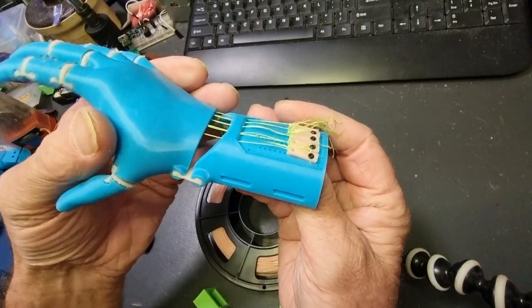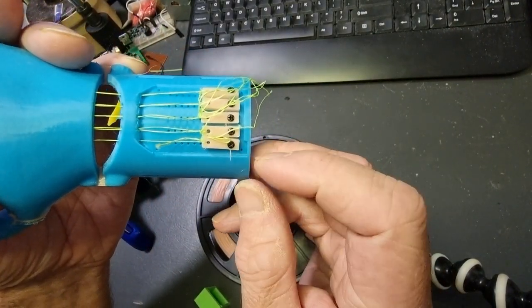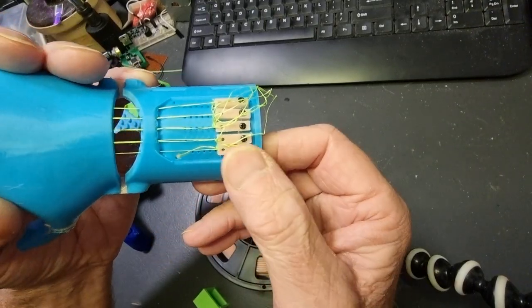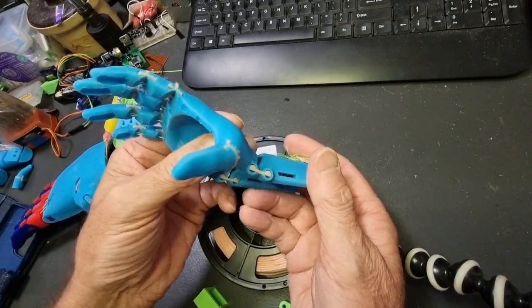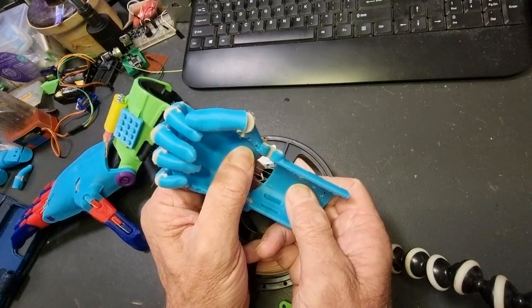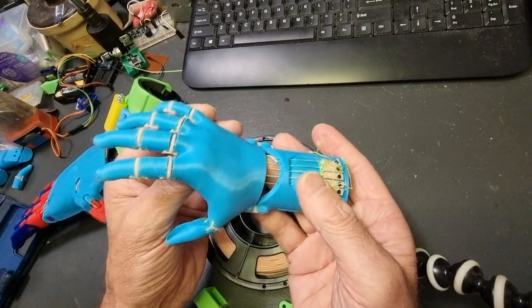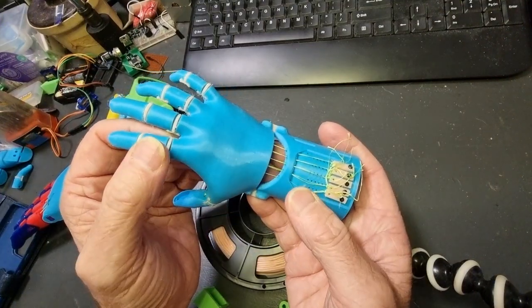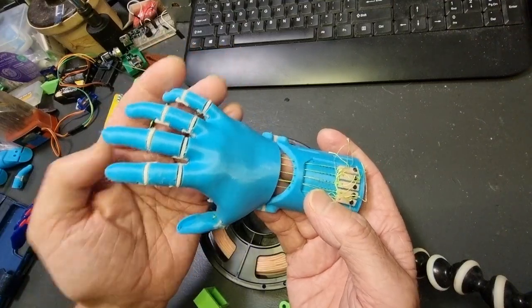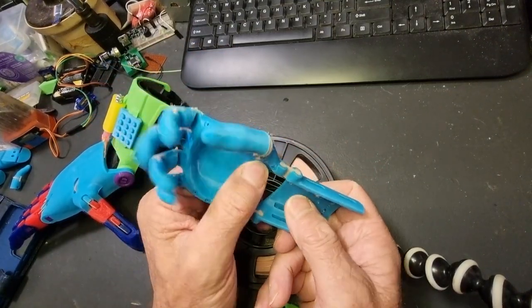With this hand, the tensioner blocks are also printed in TPU, so they're slightly stretchy if you have to put a lot of pressure on them — they can stretch a little bit. This works really well. So if you can't get dental bands, you could probably do something like this if you can get TPU filament. There's another idea to look at.